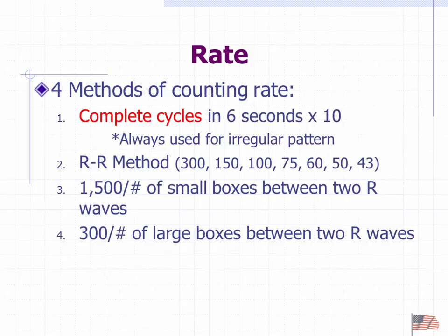One of the things that you'll need to know how to do, and it'll be a test question, I guarantee you, is determine the rate. By looking at an ECG strip, how fast is the heart rate going? Yes, I know, it'll tell you. That's not what I want. I want you to be able to determine it even if you don't have it.